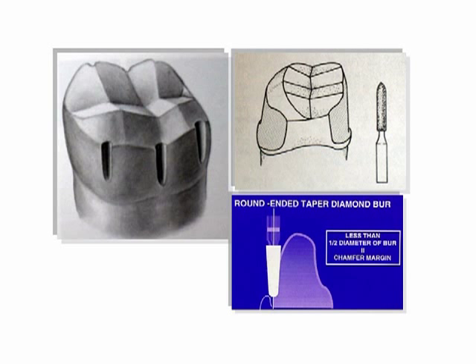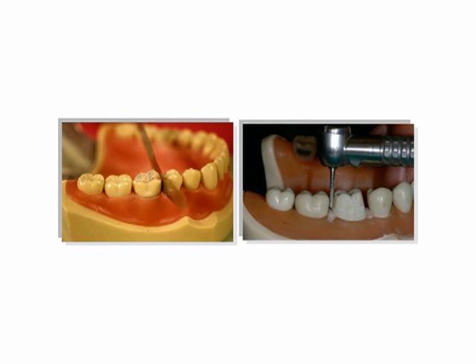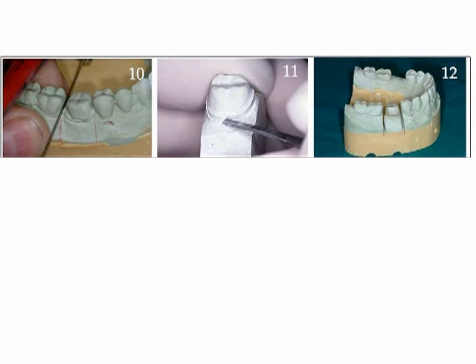Step 4. Reduce the interproximal. Avoid abrasion of the adjacent tooth. The contact area should have sufficient space to allow a die saw to be inserted without abrasion of the die. A metal matrix band and/or wedges may be placed to reduce nicking of the adjacent tooth.